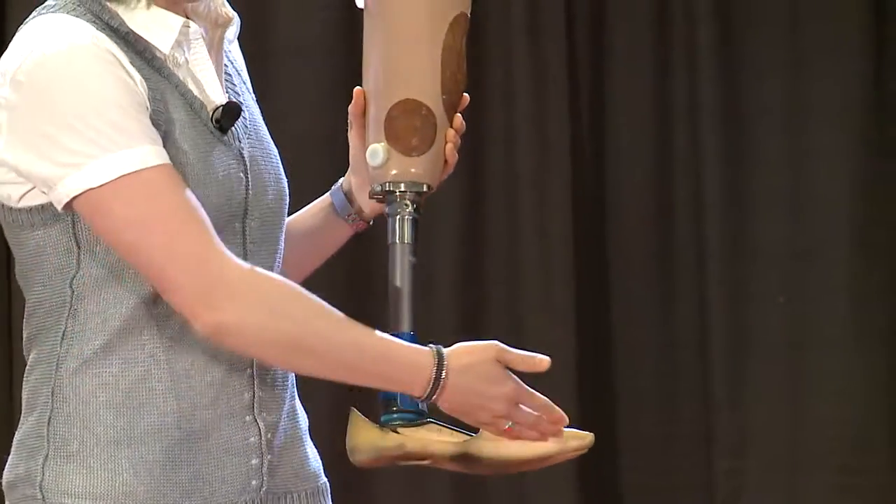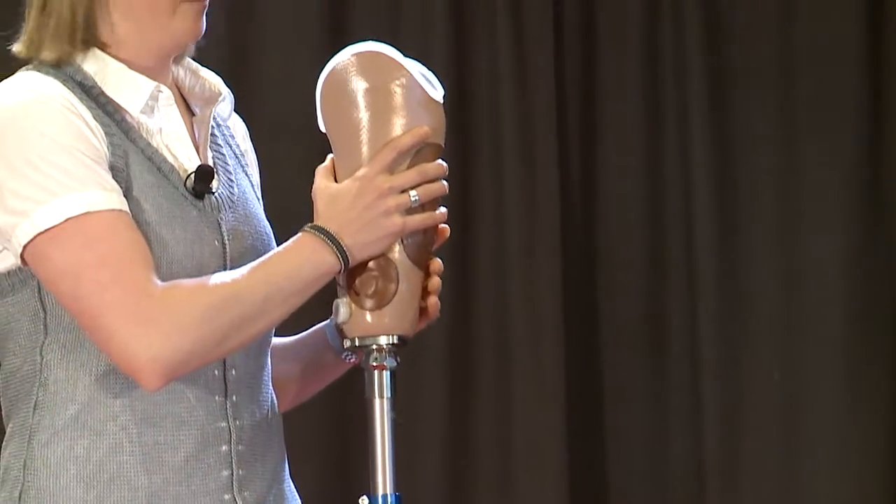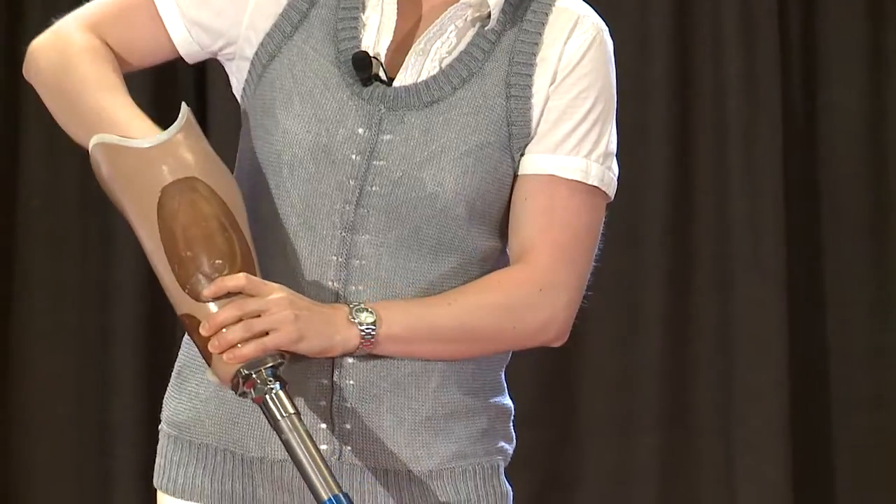It's made up of three parts. This is the foot, this is the pylon, and this is the socket. The socket is the part where an amputee's residual limb will fit into.